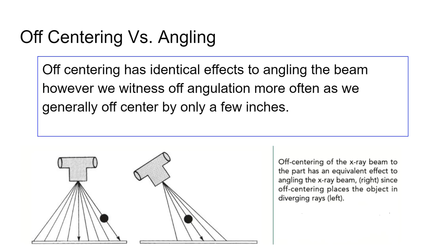Off the top of my head, I'm thinking, well, my different positionings, right? The second lowest one might be well, what? Foot is 10, 15. Clavicles are what? 15, 20. 15. Yeah. So off-centering only changes the angle of the tube. Well, the tube is not really angled, but it's the equivalent of angling the tube by a few degrees. We'll see that coming up.